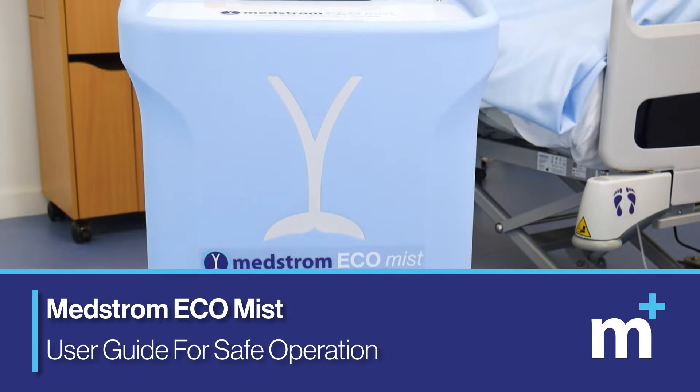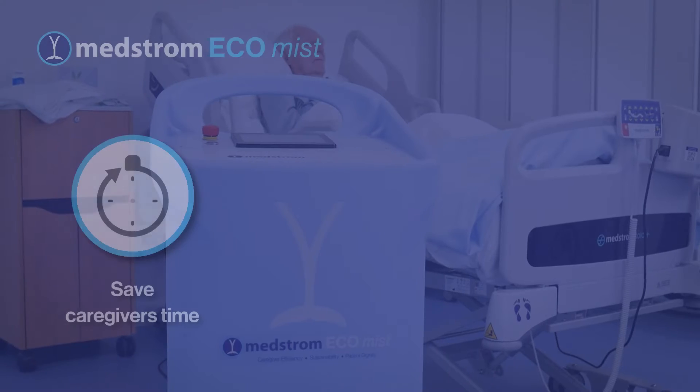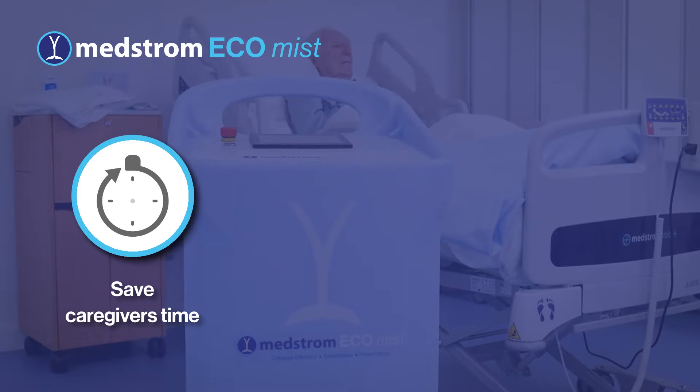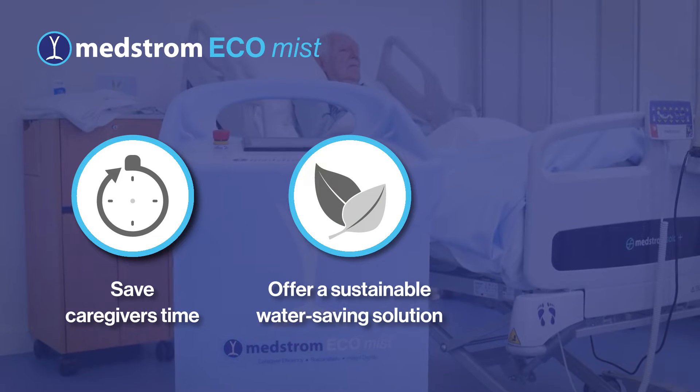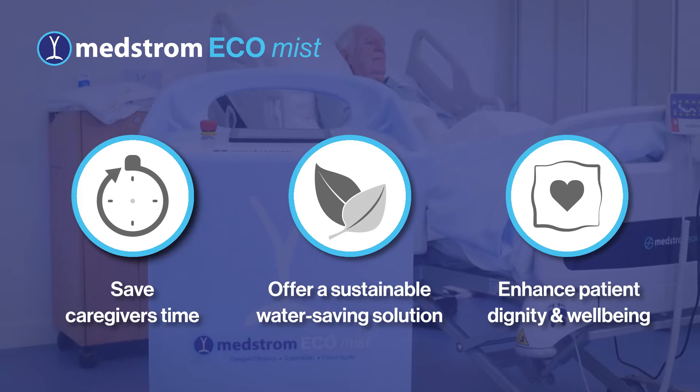The EcoMist is a portable patient washing device designed to save caregiver time, offer a sustainable water-saving solution, and enhance patient dignity and well-being.